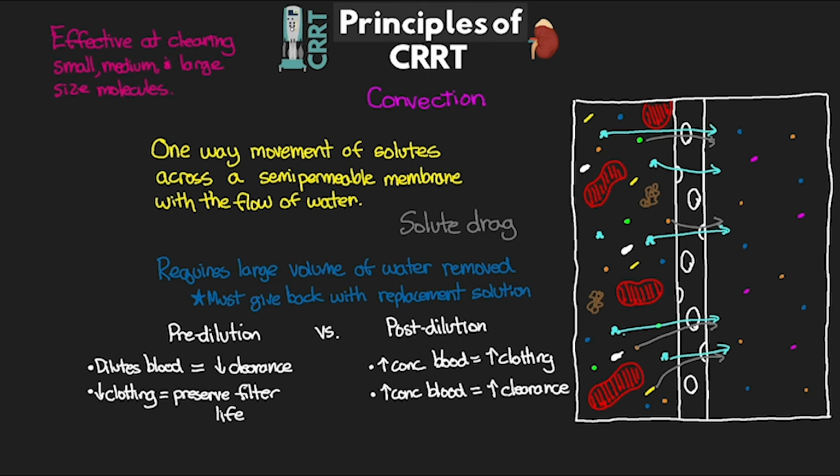So typically when we're starting out, what we actually do is a mix of both. Oftentimes I find that we run, at least starting out, equal amounts of pre and post dilution. Ultimately, the belief tends to be that we want a little bit of both. We don't want to give all of the solution either pre or post because of some of those negative consequences.